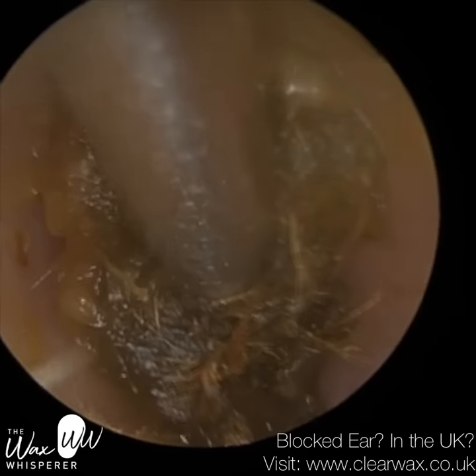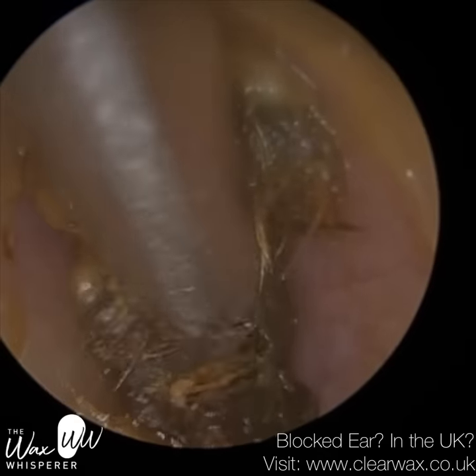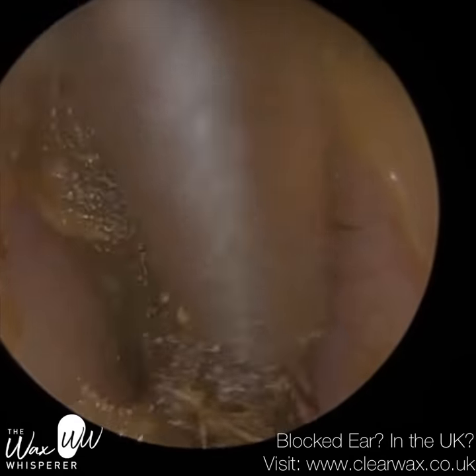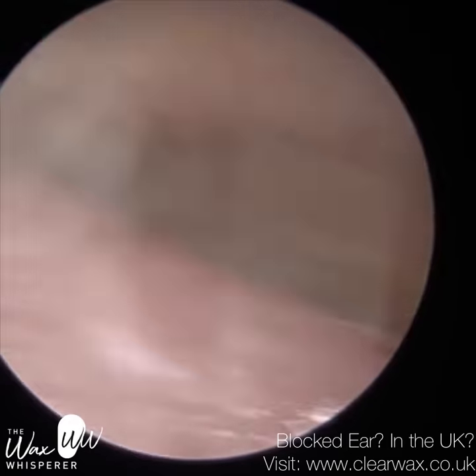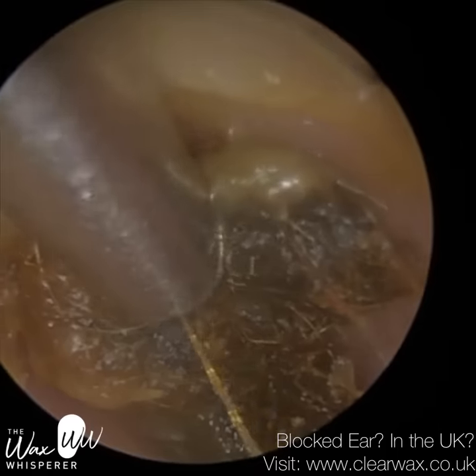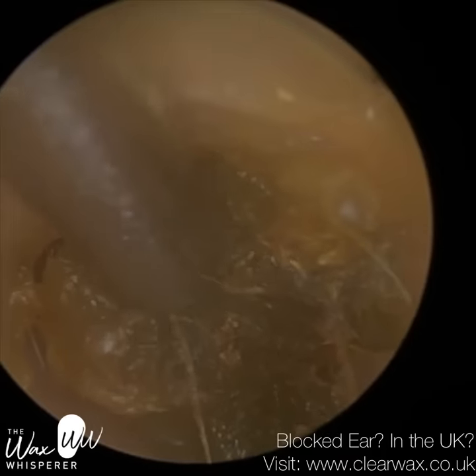But if you've got a very narrow ear canal and the wax is very deep, I don't think you always get that binocular depth perception with an ENT microscope, if truth be told, because what an ENT microscope tries to do is artificially converge your interpupillary distance. So in order to see an object in the ear canal with both eyes independently, your eyes must be very close together, and it's not possible because of the diameter of the ear canal, which is about a centimetre in height, and the width about 0.7. So a microscope, almost like a periscope in a submarine, converges your eyes closer than they really are.